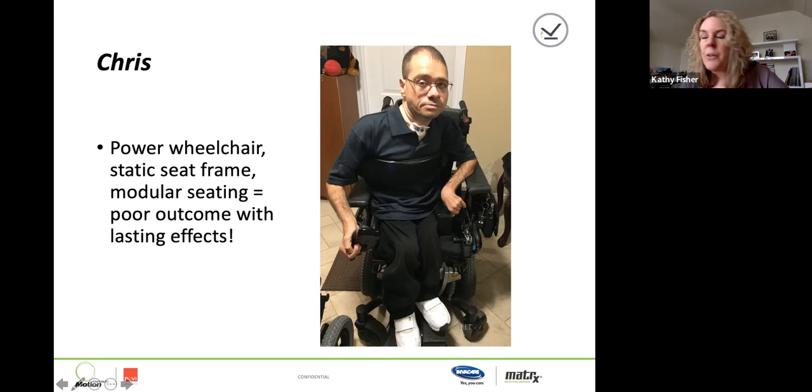This is Chris, and unfortunately he's kind of a sad story, because when I met Chris, he had been sitting in this power chair for 6 years. When I met him, I didn't have any information other than that I was coming to work with the provider and the therapist to get him a new chair and to do custom seating.